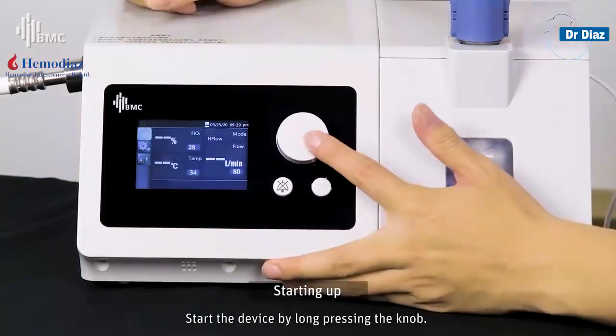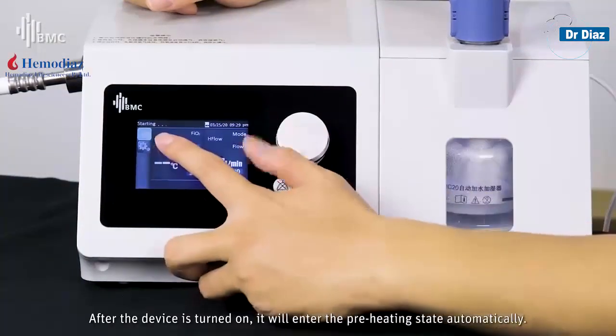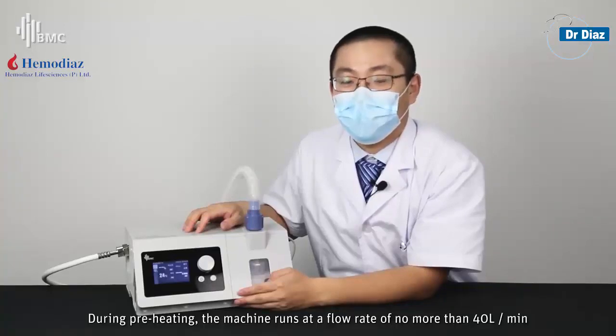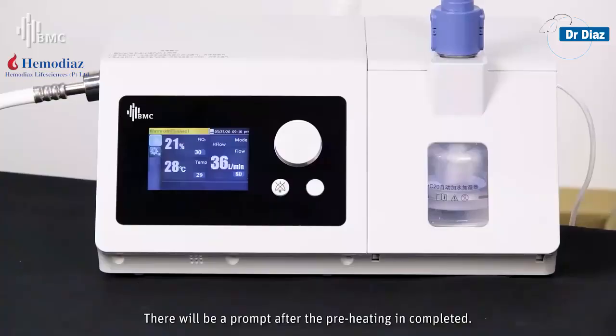Start the device by long-pressing the knob. After the device is turned on, it will enter the preheating state automatically. During preheating, the machine runs at a flow rate of no more than 40L per minute to prevent steam from spreading into the host. There will be a prompt after preheating is completed.